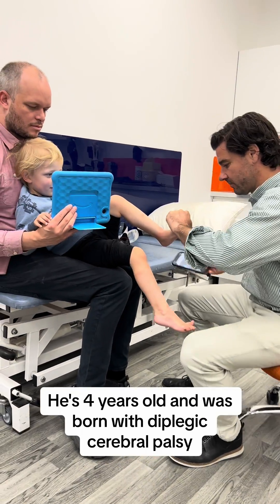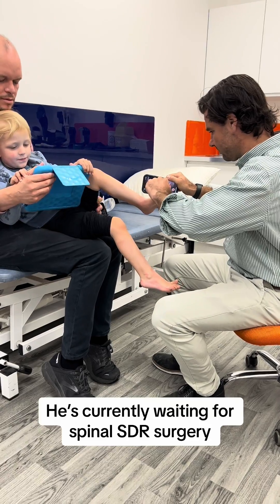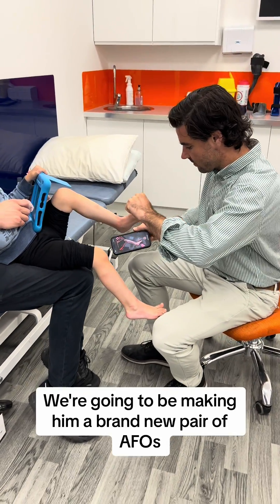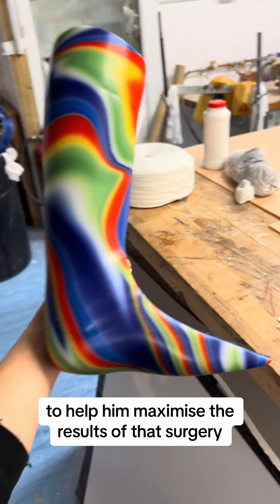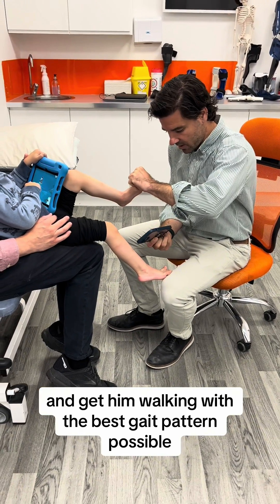This is Asger. He's four years old and was born with diplegic cerebral palsy. He's currently waiting for spinal SDR surgery — selective dorsal rhizotomy. We're going to be making him a brand new pair of AFOs, or ankle foot orthoses, to help him maximise the results of that surgery and get him walking with the best gait pattern possible.